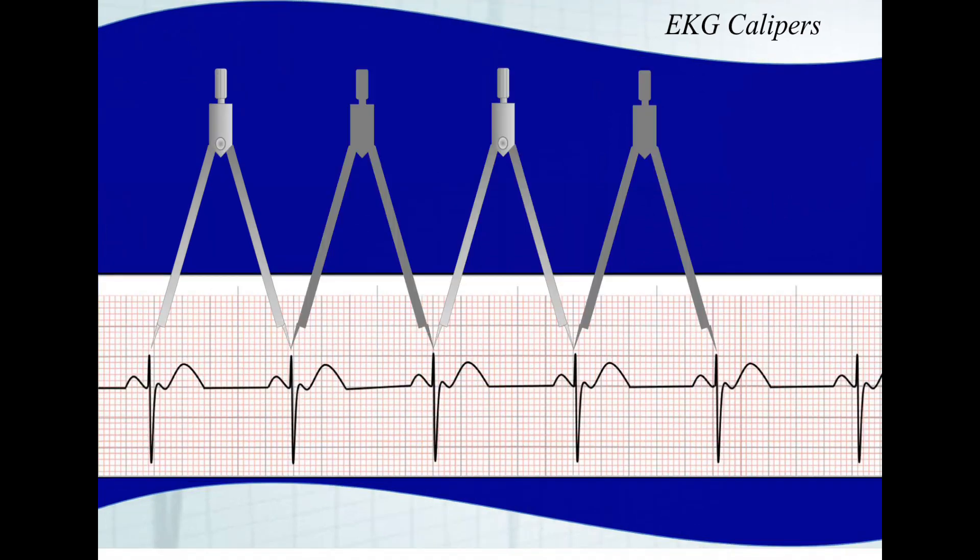Here the EKG caliper is being used to determine regularity. You place it between two R waves or two waves on an EKG, and then you spin it on one point. If it matches up from here to here, and then from here to here and continues, then we say the rhythm is regular.